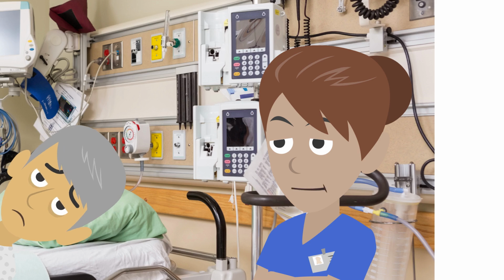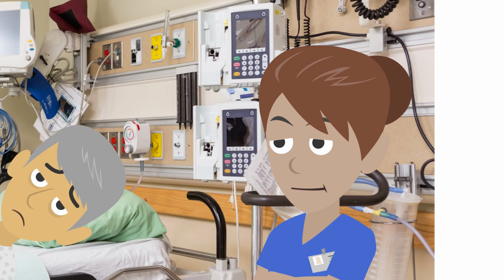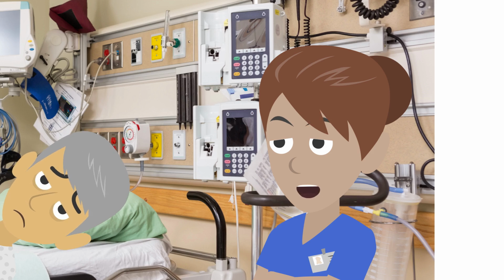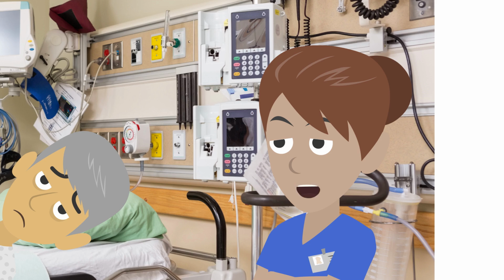After I've inserted the tube, I'll syringe out some fluid to test with pH indicator strips. That checks that the naso-gastric tube is in your stomach and it's safe to give you liquid feeds. Once I know the tube is in the right place, I'll secure the tube to your nose using some tape. That just prevents the tube from being accidentally pulled out.